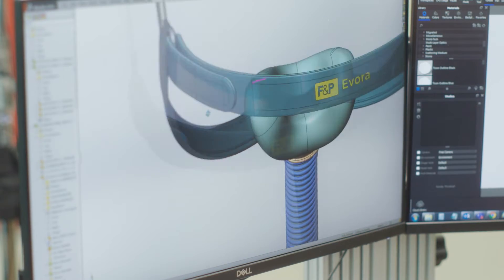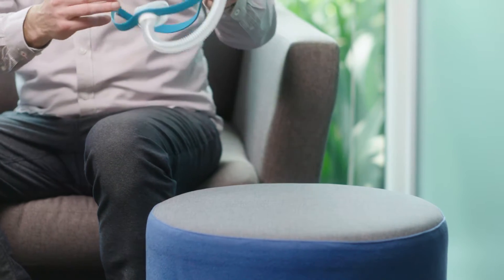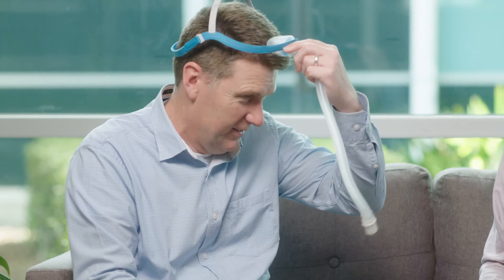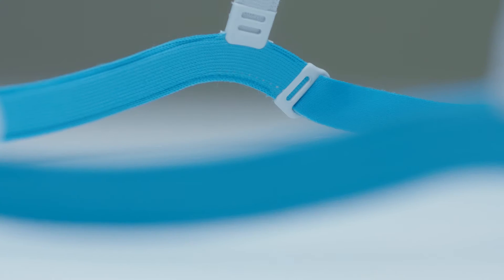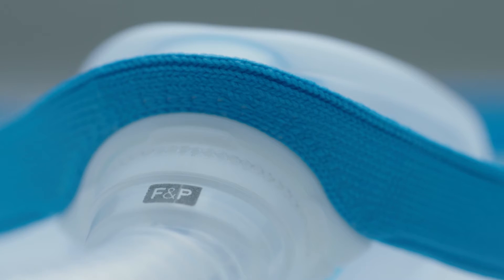Some of the features of the Evora compact mask would be the headgear and the way it holds its shape during fitting. We have these arms that support the mask, supporting the top strap and the back strap, so you can just put it over your head like a cap. We're really proud of that. We have the air edge feature along these arms, and that really makes it comfortable on the face and makes it feel like something that belongs in the bedroom.